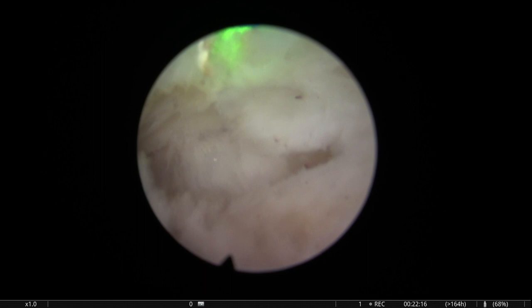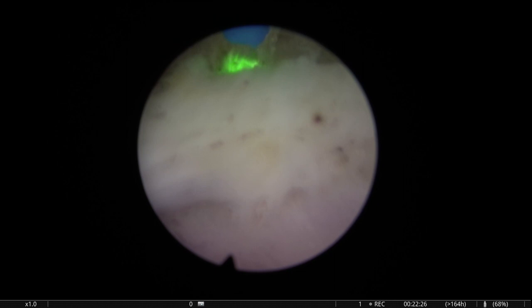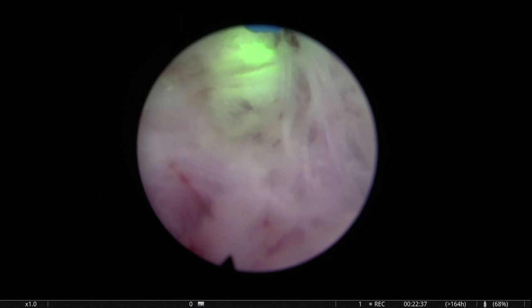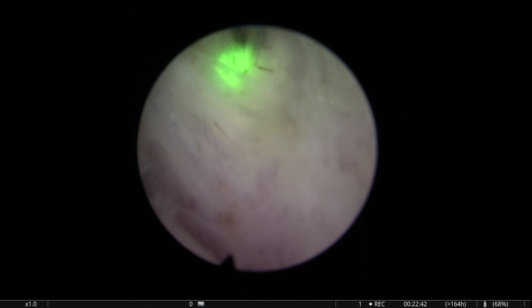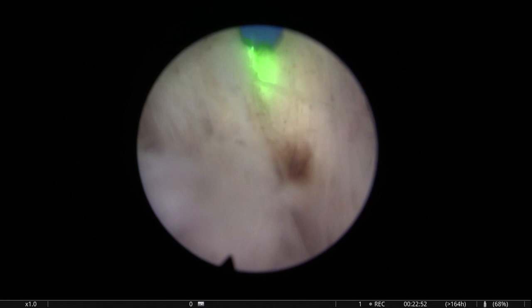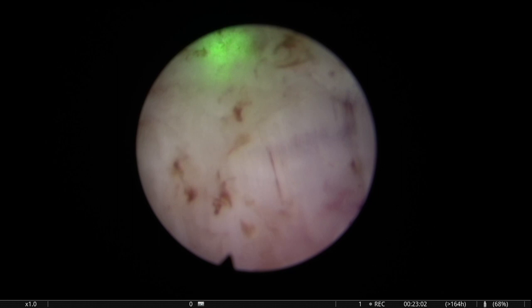And I took out the postoperative ultrasound of the guy, showing this amazing fossa. And I took out the histopathological analysis, and it was 100 grams of tissue, and I said, what's going on? He had just a nodule at the apex, which was causing this obstructive effect. It obstructed micturition completely. So we did a removal under sedation of this very small nodule, but obstructive nodule at the apex. And I learned the lesson. Despite removing a lot of tissue, if you want to achieve your goal, which is to provide a long-standing, definitive effect, you have to be thorough and look for the nodules.